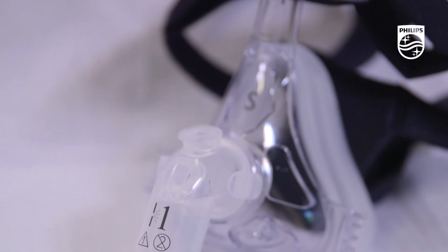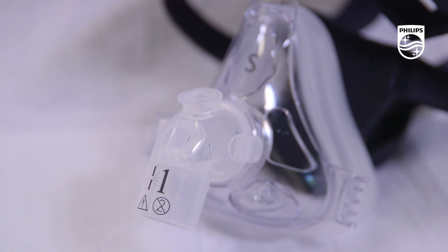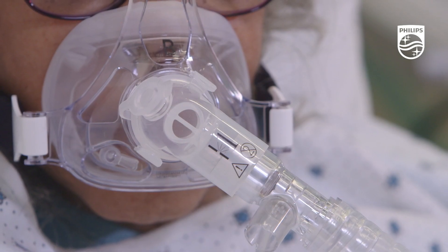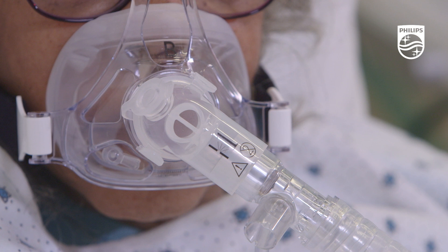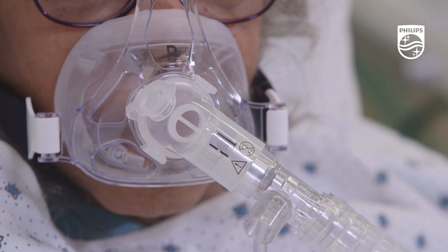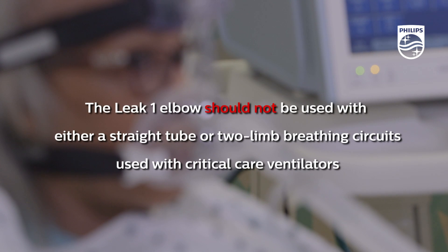The Leak 1 elbow is intended to be used with a dedicated single limb BiPAP circuit that incorporates a dedicated exhalation port, such as the Disposable Exhalation Port, or DEP. The Leak 1 elbow has a minimal intentional leak that is not sufficient to eliminate exhaled CO2 from the patient, and should not be used with either a straight tube or two limb breathing circuits used with critical care ventilators.